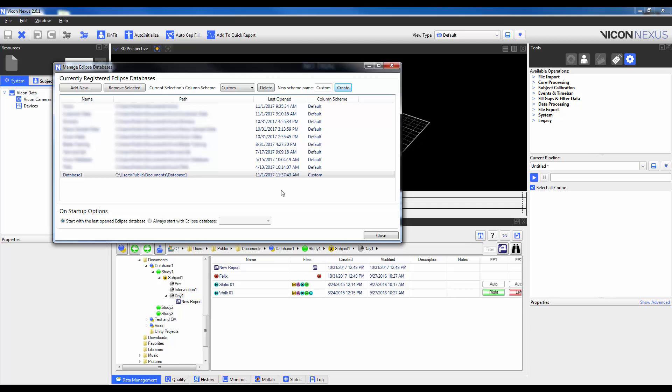To change the Column Scheme, I can use the drop-down menu here. I will keep it at Custom so we can look at how we might modify the layout of a Column Scheme. So what I'll need to do is enter a database that is currently using the Column Scheme I want to modify, and then navigate to a session.